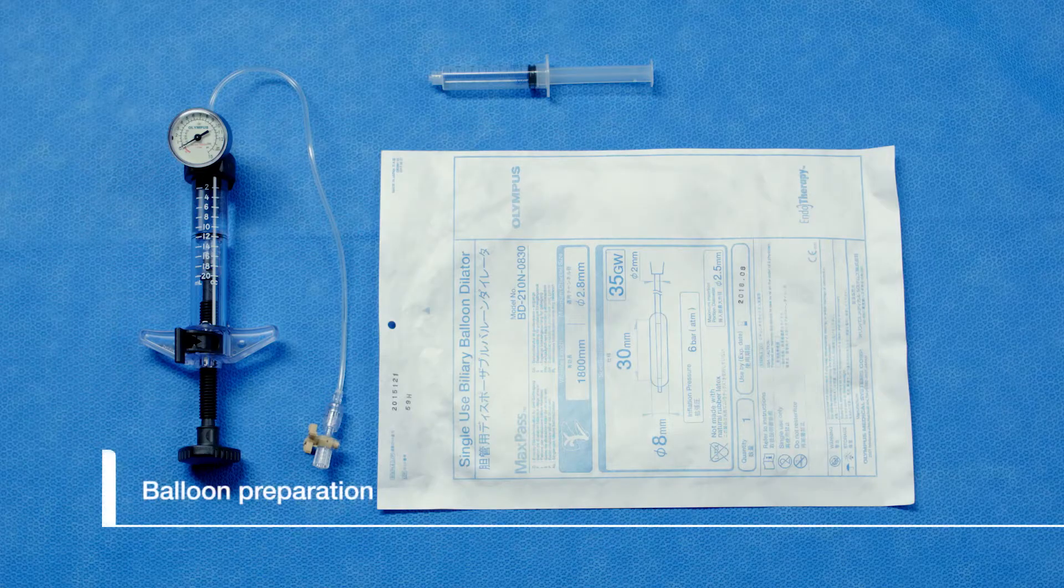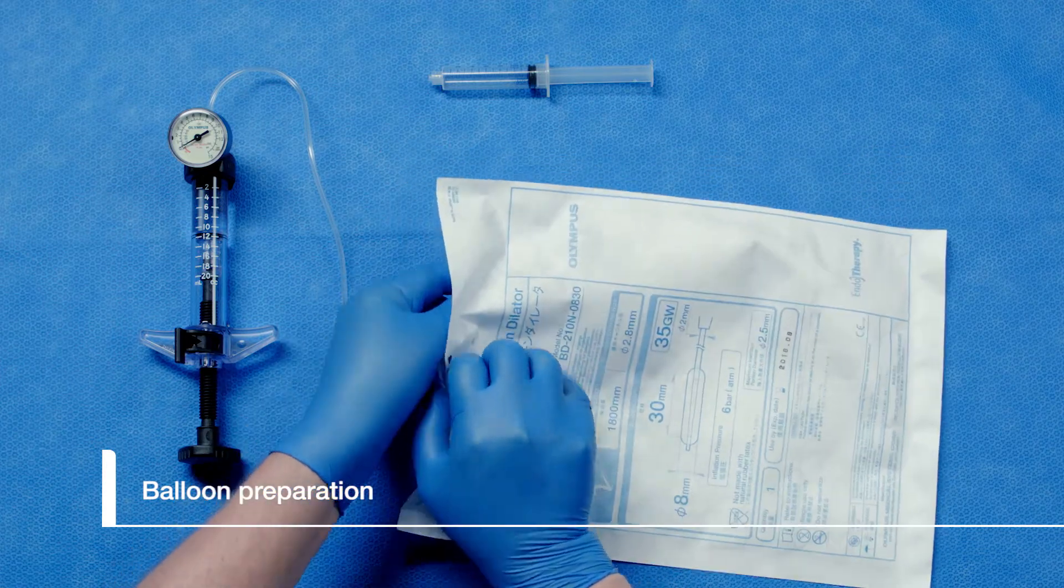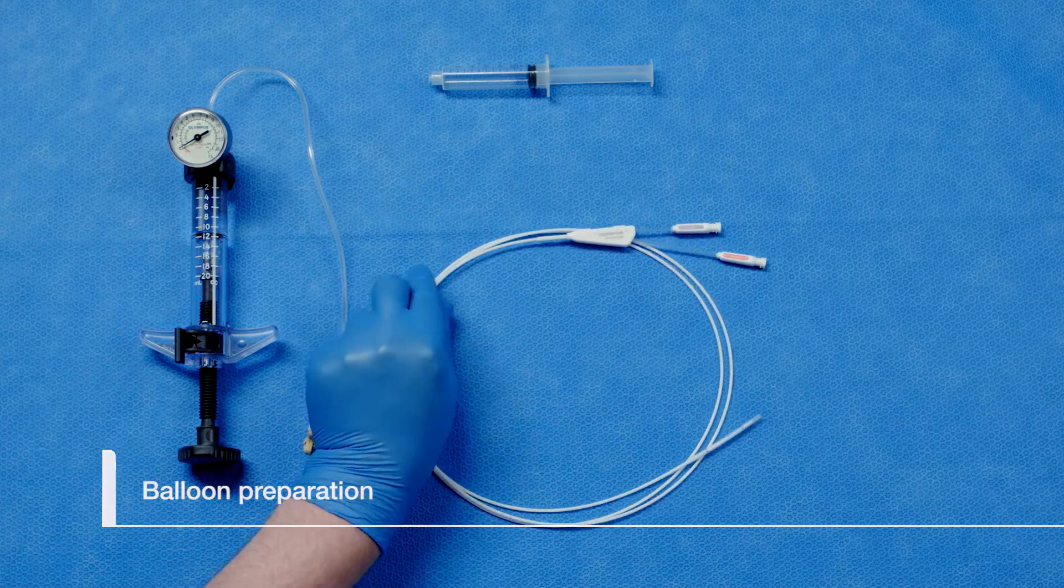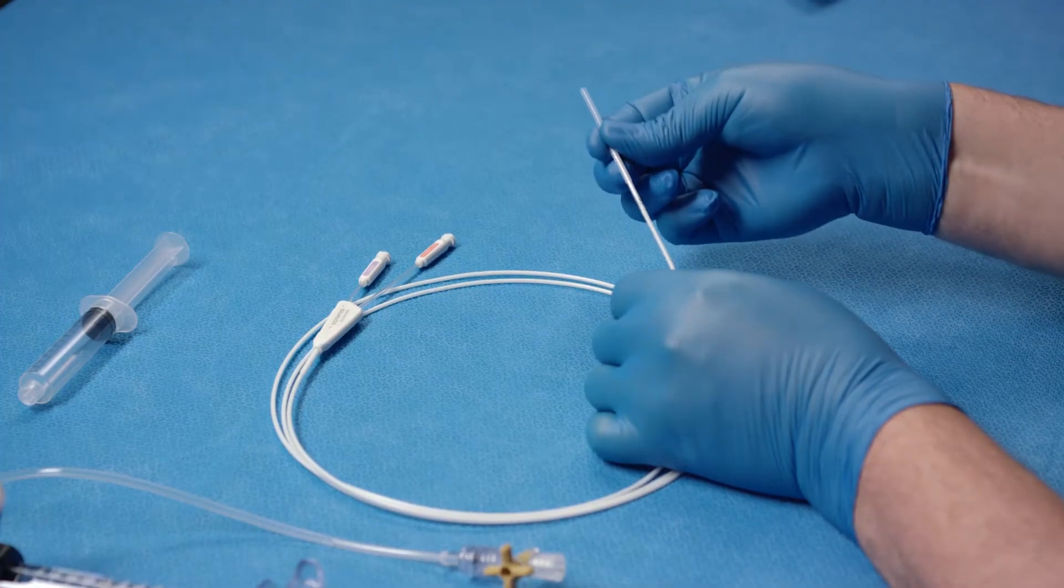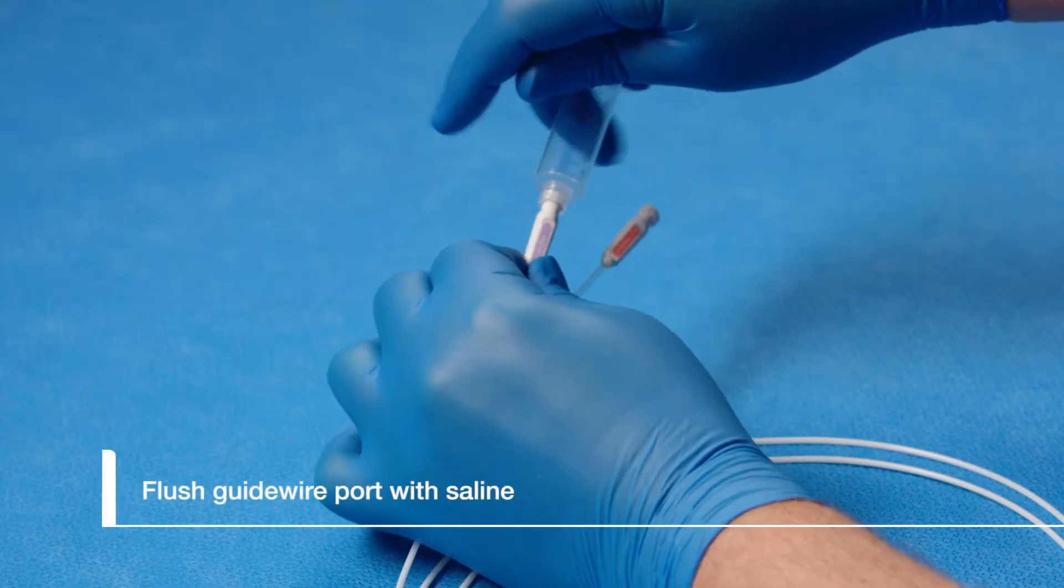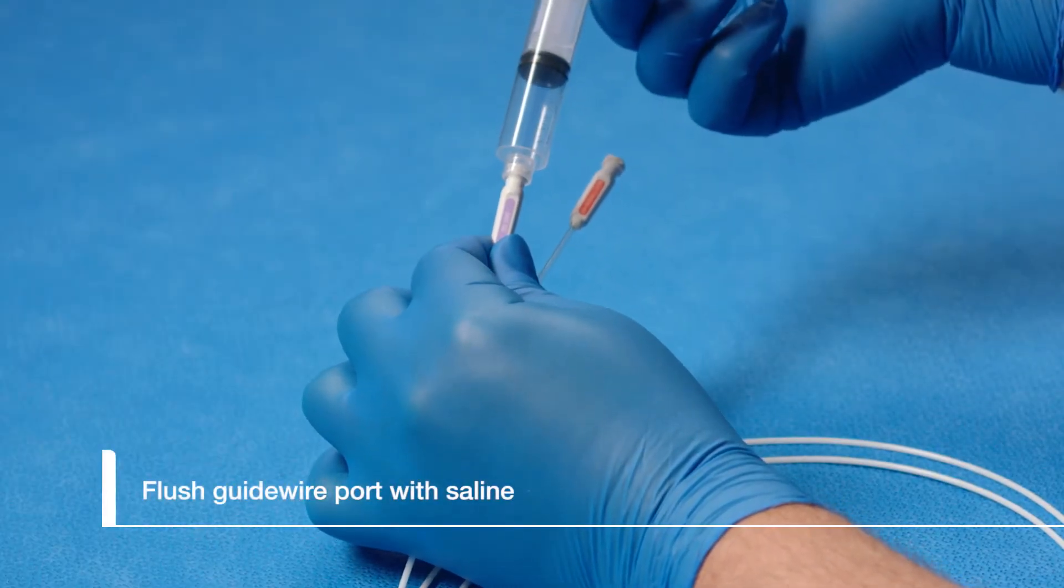Now we will prepare the MaxPass dilation balloon. First, remove the protective sleeve from the distal end of the balloon. We will need to flush the guide wire port on the balloon.